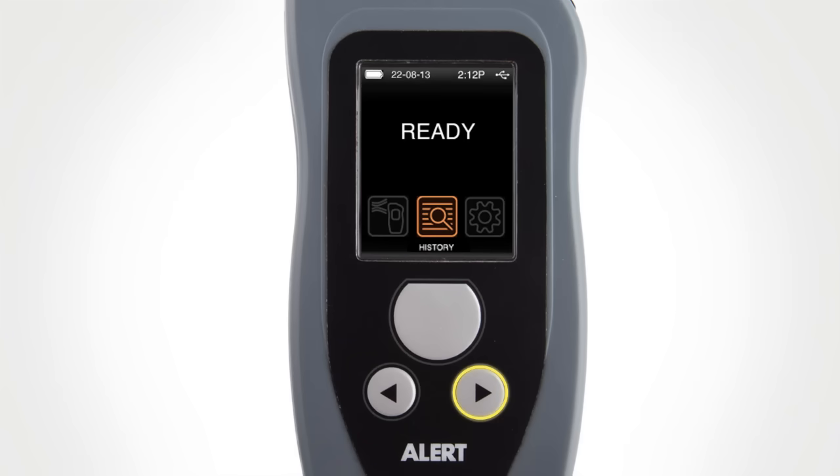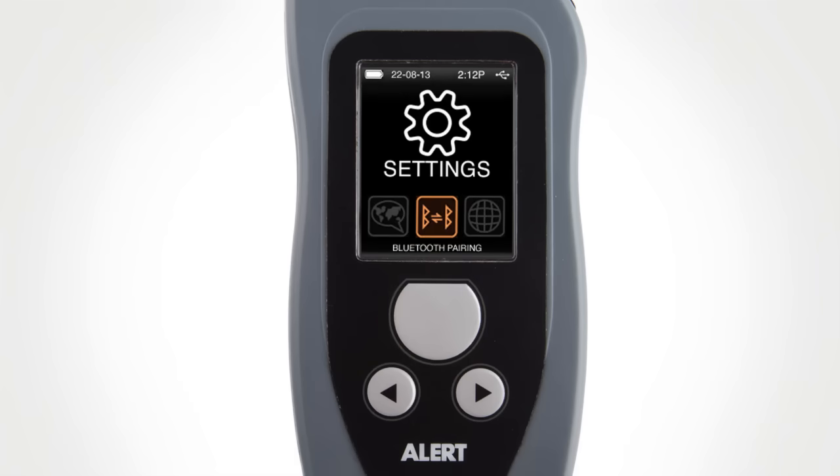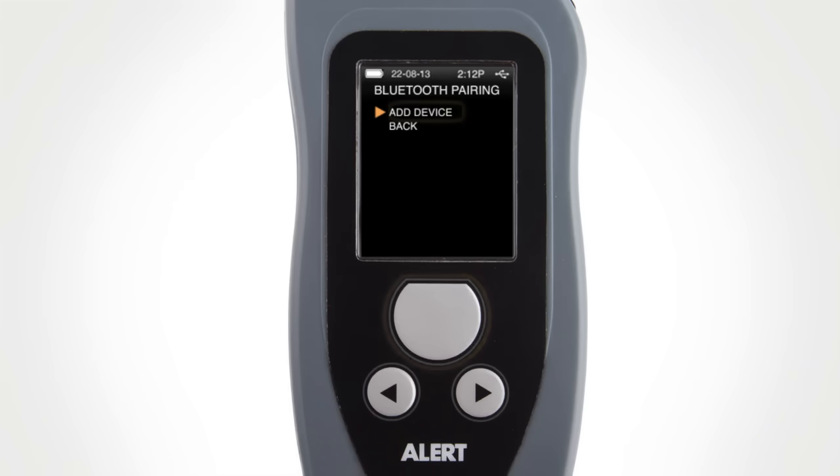In the main menu, scroll to the settings icon using the navigational buttons. Select the Bluetooth pairing icon by pressing the main button. Use the buttons to scroll and select Add Device by pressing the main button. Select the printer with the main button and enter the password.